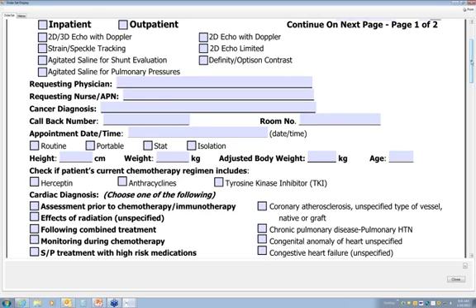Yeah, I know. At the beginning when we started, we were on the learning curve for over a year, and we didn't do it routinely. Of the 70 echoes that we do on average, really the average is more like 63, 64. Yesterday we probably did 70. Some days we get that high, but probably half of them we do the AFI.